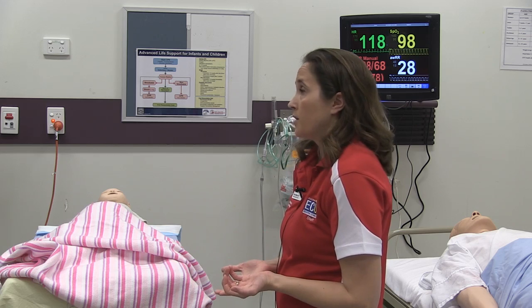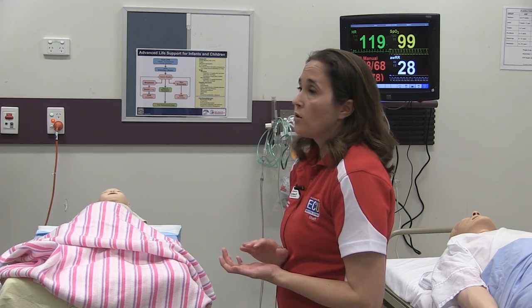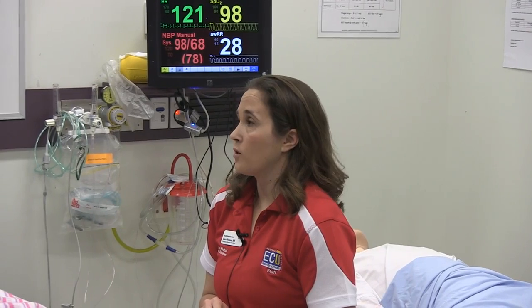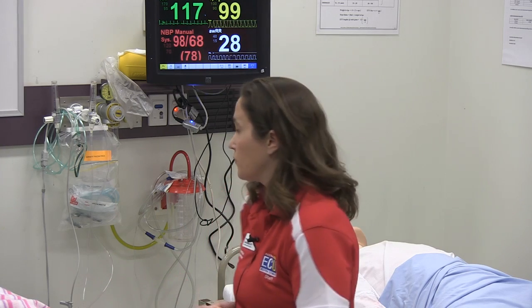You've written the scenario, but your students or your learners or your participants have their own set of skills and experience, and they really drive the scenario. So you have to be open for unanticipated actions from the learners and have contingency plans in case they do something with a scenario that you didn't anticipate. We do a lot of working on the fly in simulation, but we also try to have built-in contingency plans and backups for if this happens, we're going to do this.